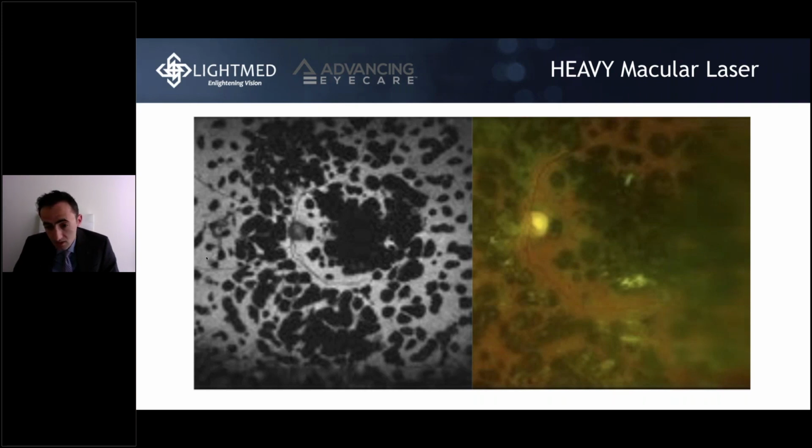And still you get excellent results, no pain. But I would say the 561 probably is falling for me in between. So rather than starting with 200 milliwatt on the power or 240, I sometimes start with 220. And of course you have to gauge it per patient, because depending on the pigmentation within the retina, within the choroid, within the RPE, they have different absorption for the laser. So this is the first issue when you're treating with PRP.